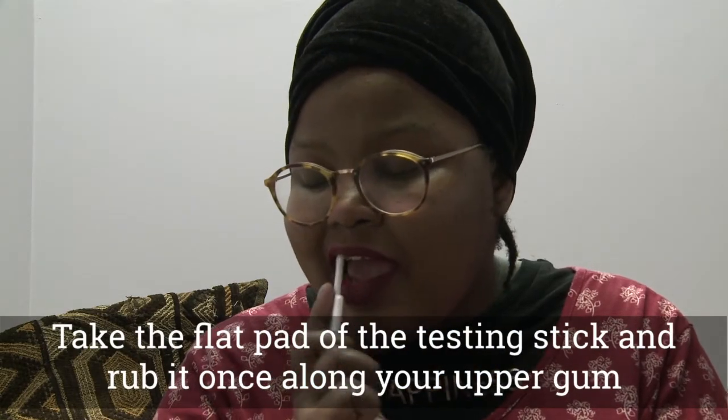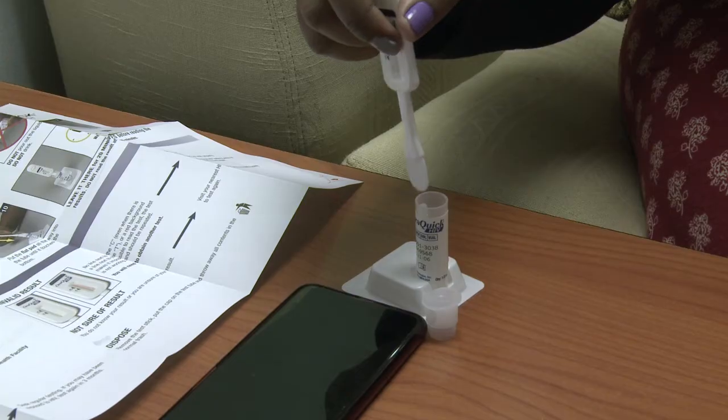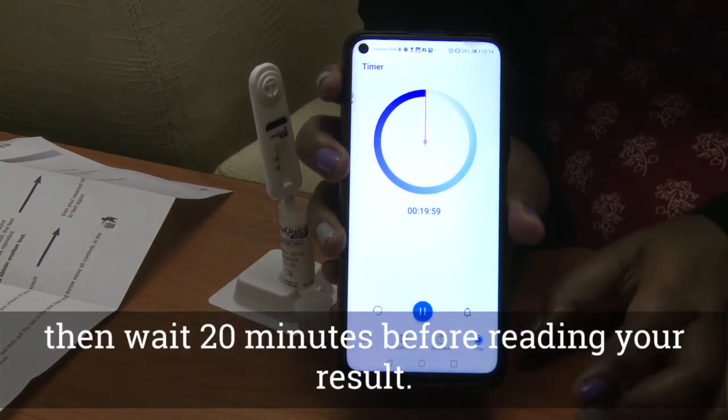Take the flat pad of the testing stick and rub it once along your upper gum and once along your lower gum. Put the flat pad in the tube all the way until it reaches the bottom, then wait 20 minutes before reading your result.